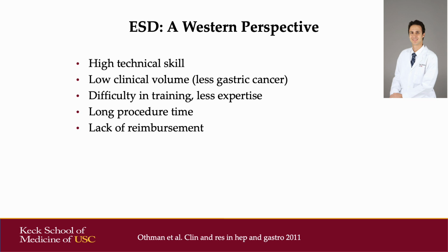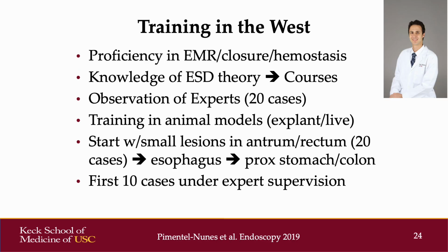And most large training programs do tend to have ESD procedures being performed. The procedure time is much longer than performing EMR, and we do have a lack of reimbursement in Western countries for ESD, which makes this difficult.